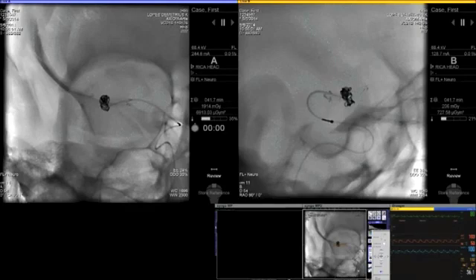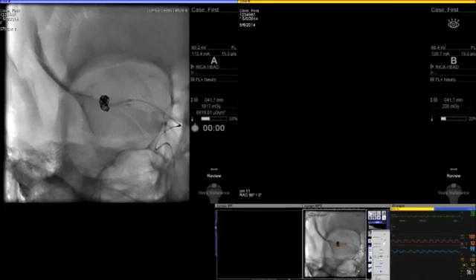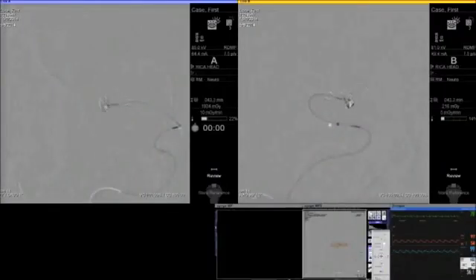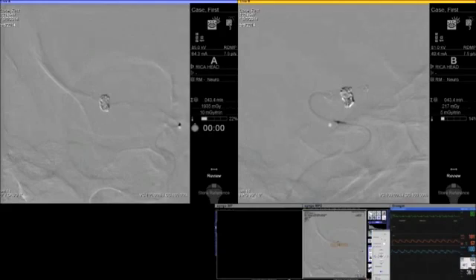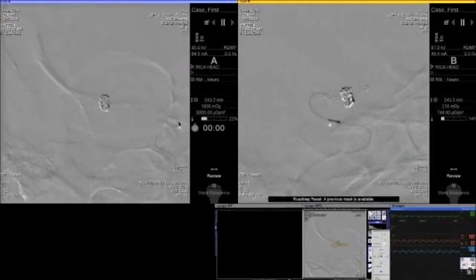Once we were satisfied with the closure of the aneurysm, we proceeded to basically check the coil mass. This is a very challenging portion of the procedure, like when is enough to coil this, but we tend to do this under a blank roadmap, as you can see here, and you analyze that every one of the segments of the aneurysm is at least being filled by the coil.